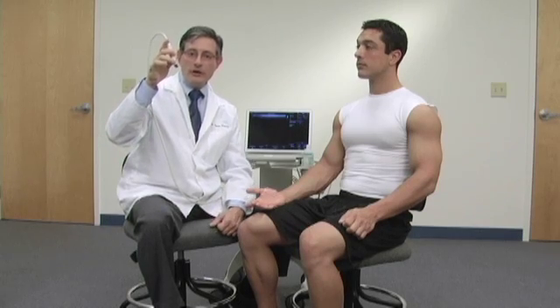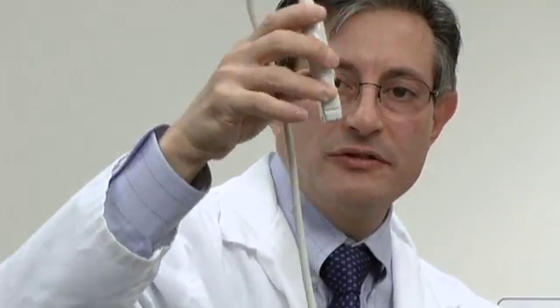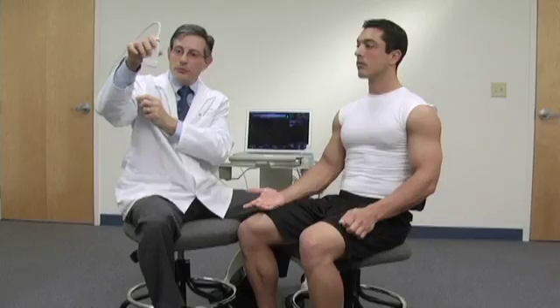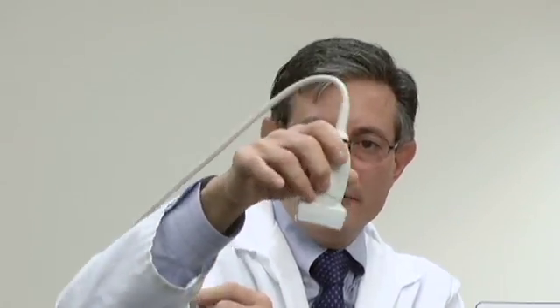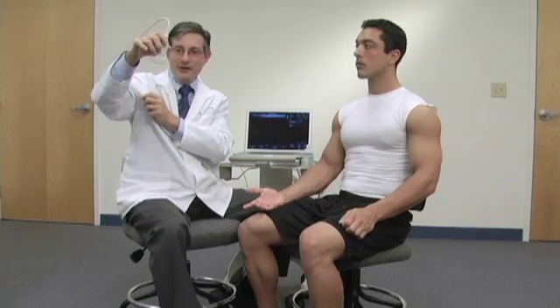In order to correct for anisotropy, we do something called toggling of the probe when we're in transverse. Toggling means tilting the probe this way. Another technique, particularly when we're in long axis to a structure, is that we can tilt the probe this way and this way. This is known as heel-towing — just like moving the foot in dancing, heel-towing.